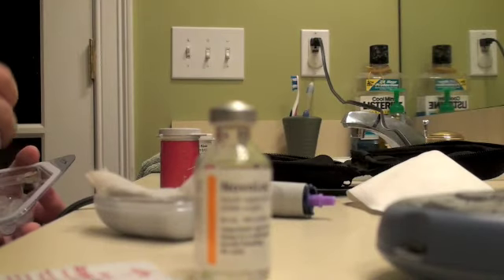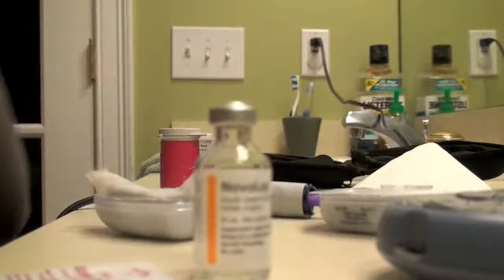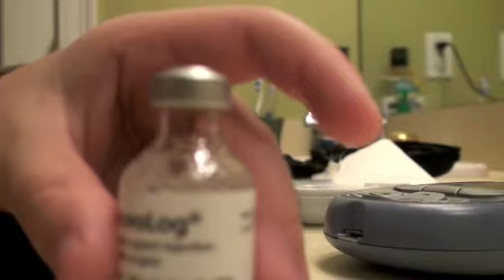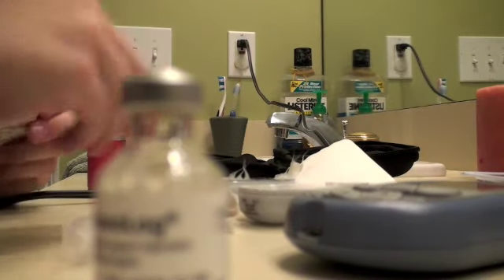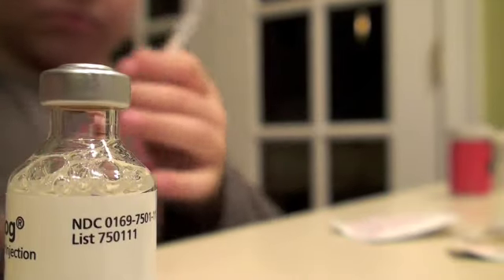Mom, can I take it? No. I have to get the other insulin. Here, where are you? You got it on? Okay, we got a new vial of insulin. Can you clean off the vial of insulin? Okay. This is the new one. This is the old one. We're going to put that in the garbage there. And then just pull it off.